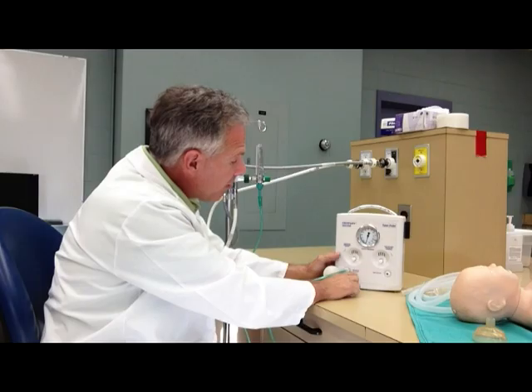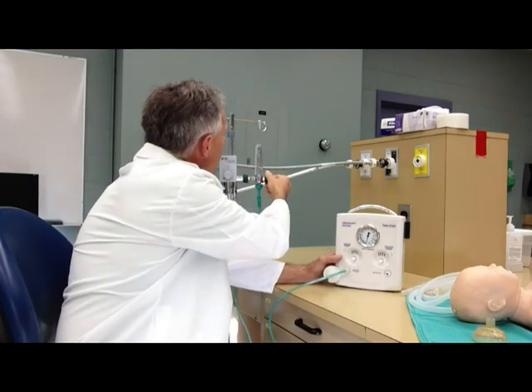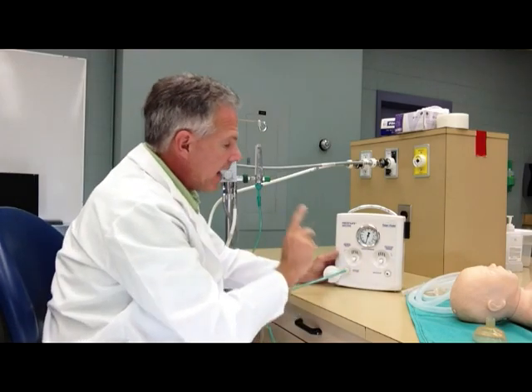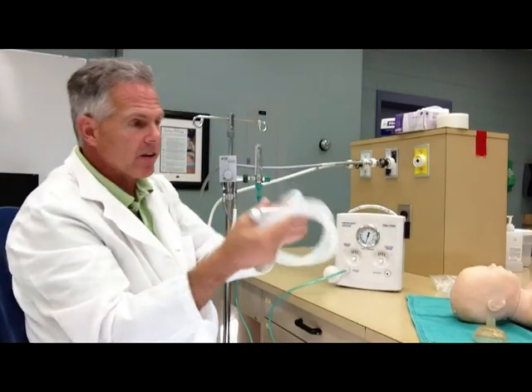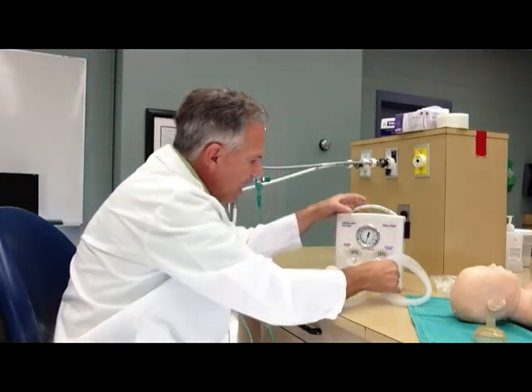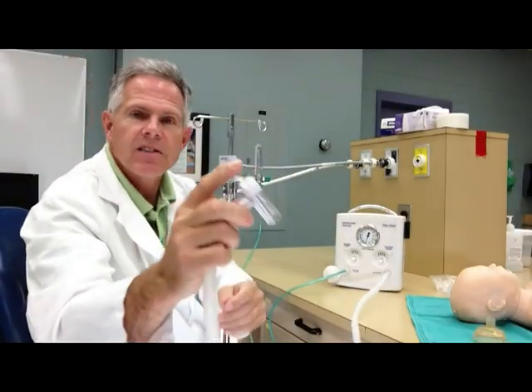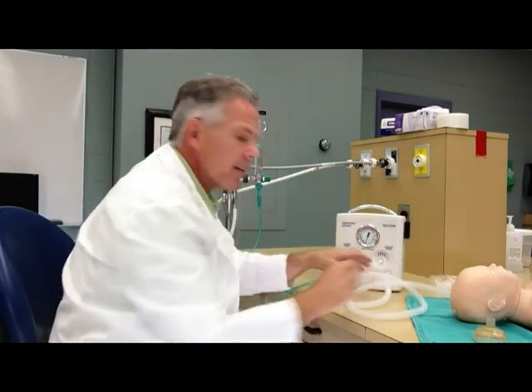It tells you right on here which flows to use — between 5 and 15. We're going to use a little on the higher end. The patient circuit goes to our gas outlet, which goes right to our patient. It's got this little spring valve on the end here. We'll set that off to the side.